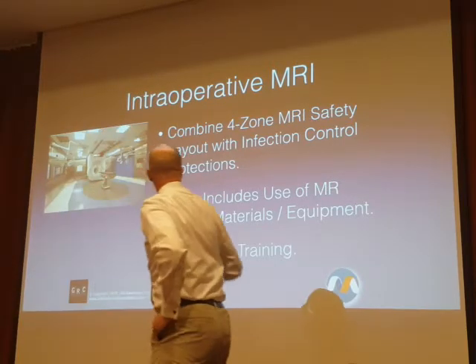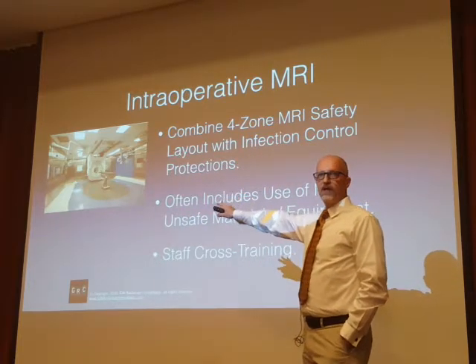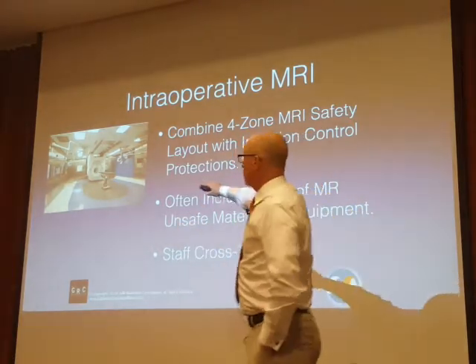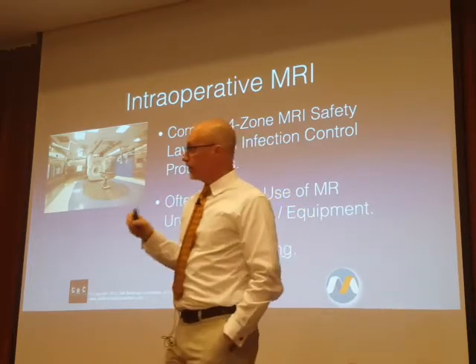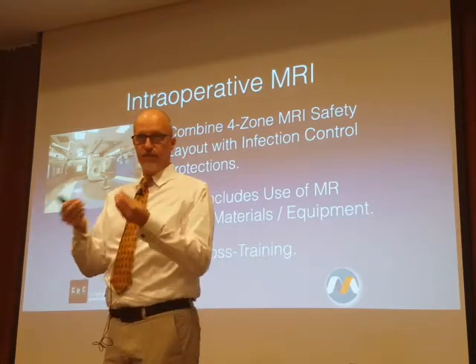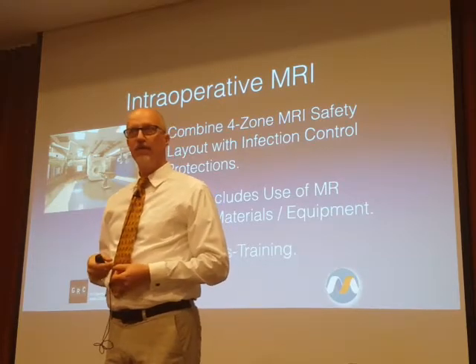And it's something we need to think about. One of the complications in these OR environments is a lot of times, especially with these moving magnets, we may use conventional surgical devices. We may use conventional scalpels and hemostats and things that would go flying at the magnet if the magnet was in the room at the time.